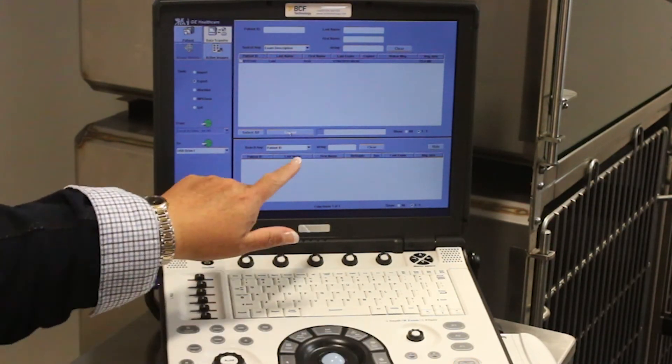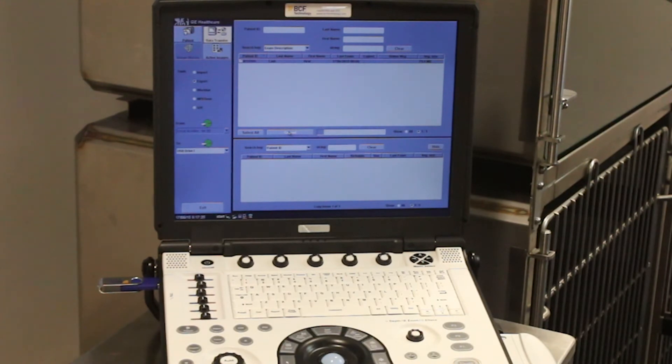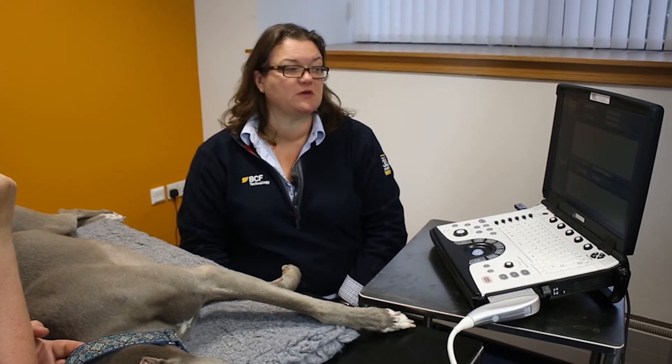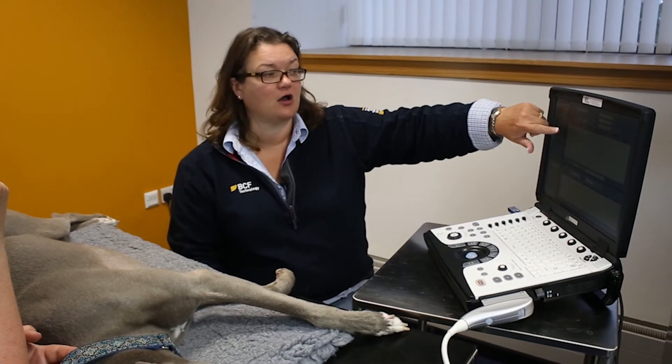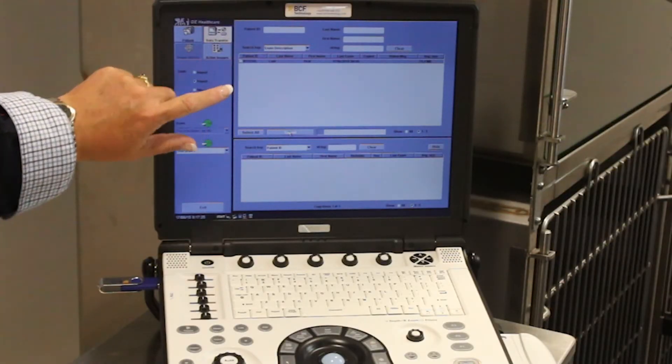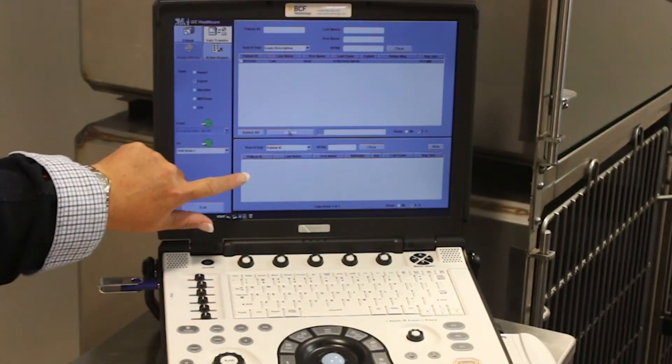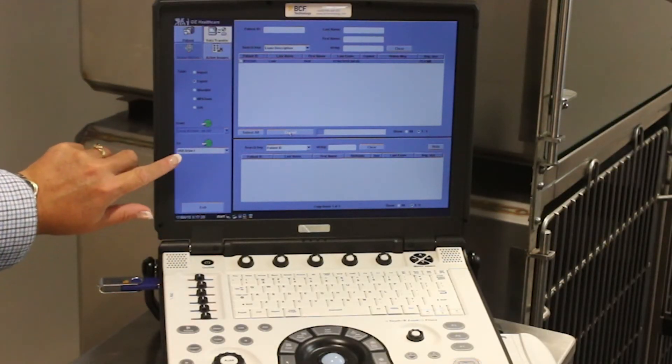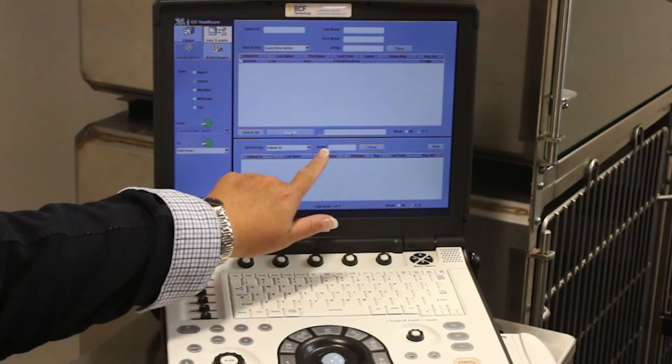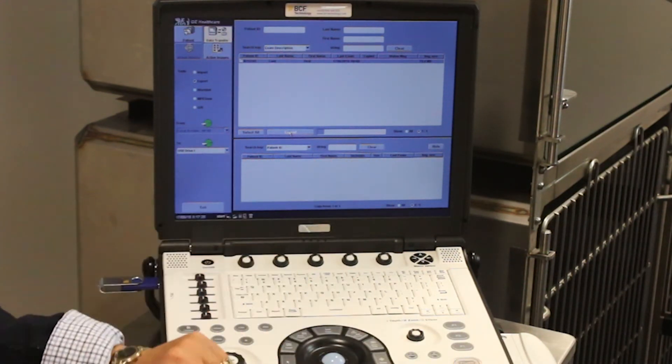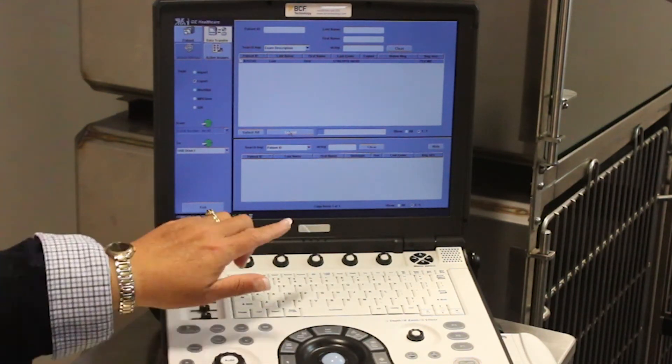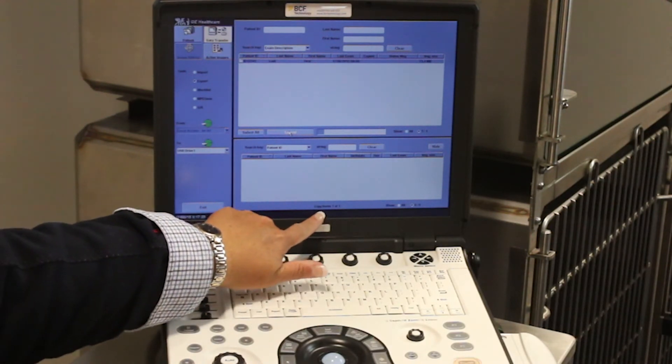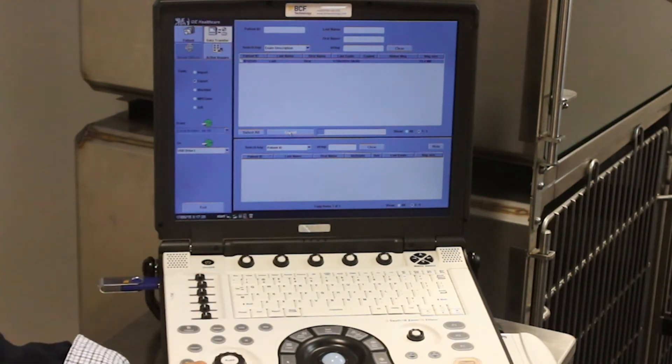you can see we now have a progress bar, and the information from this patient is being transferred from the hard drive of the machine to the USB stick that's in drive one. We'll be able to see the progress of this as it happens along here. It also tells you at the bottom of the screen that it's copying items one of one.